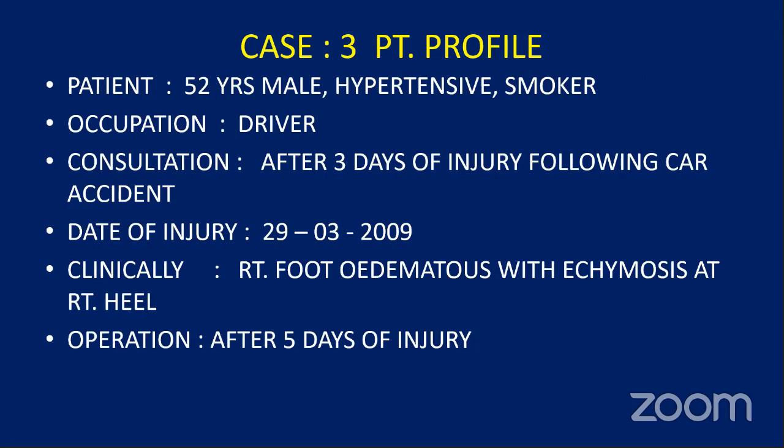Anjan sir, you can please continue. Yeah. This is a 52-year male, hypertensive and smoker. Occupation is driver, consultation after 3 days of the injury, a car accident. Date of injury is 29/3/2009. Clinically right foot edematous with ecchymosis at right heel. Operation was done after 5 days of injury.